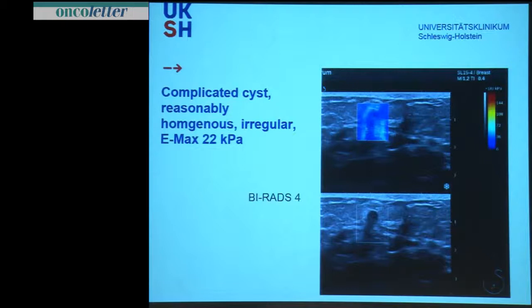Looking at this lesion: a hypoechoic lesion on the dorsal part, not very well defined — we call this a BIRADS 4 lesion. In shear wave there is a quite homogeneous finding; Emax was only 22 kilopascal. This was also biopsied and turned out as a complicated cyst.